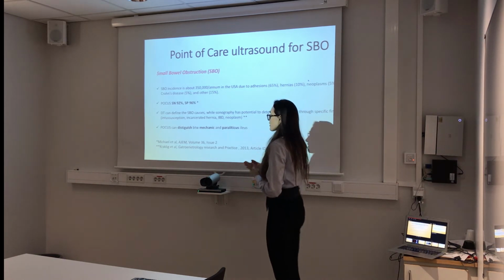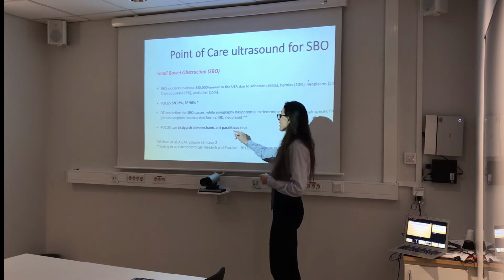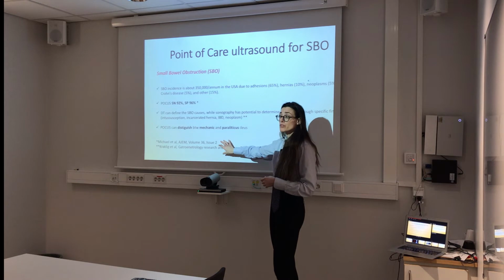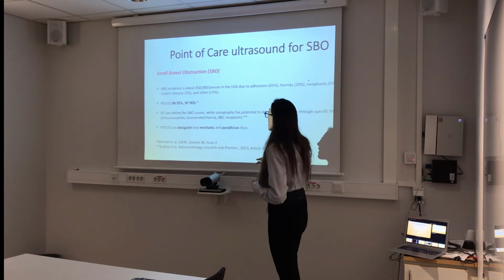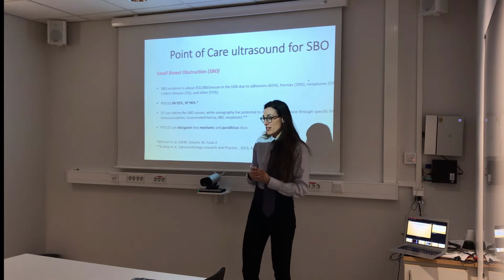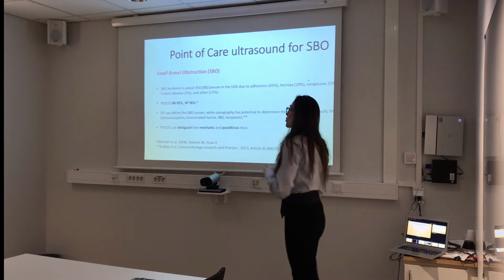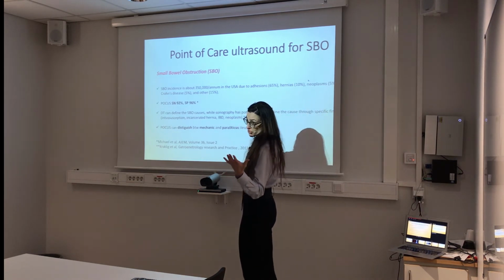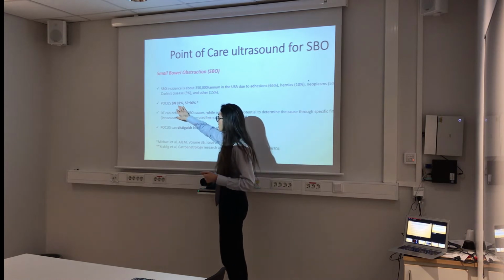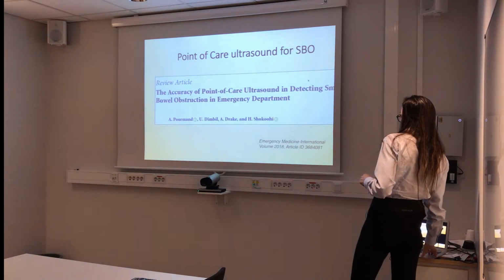So can point of care ultrasound also distinguish mechanical and paralytic ileus? Yes, it can, and this is in the literature. I put down the articles, if you're interested, that you can read, because in many cases point of care ultrasound was able, as I said, to see the intussusception, so to understand the primary cause of the small bowel obstruction. The sensitivity of POCUS in the literature overall was 92% with a specificity of 96. We will see the two articles that I reviewed for you.